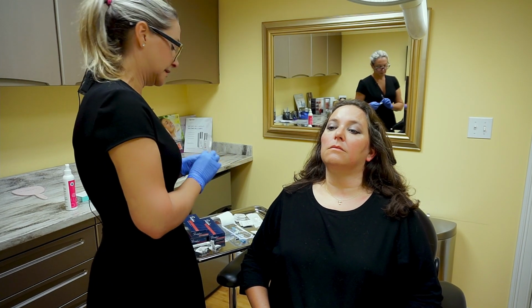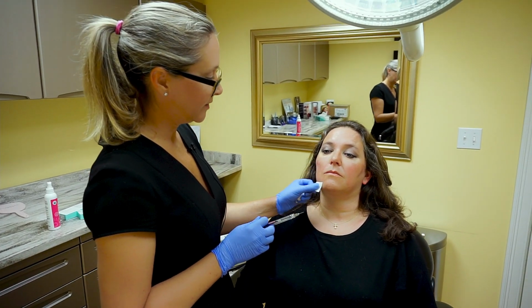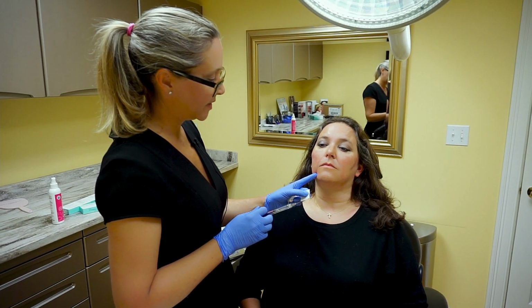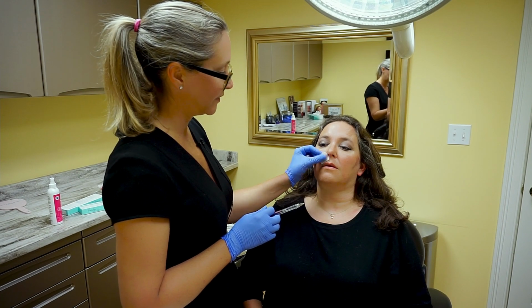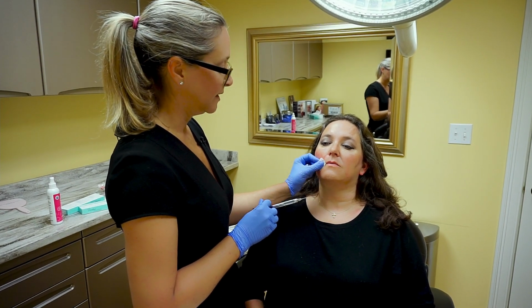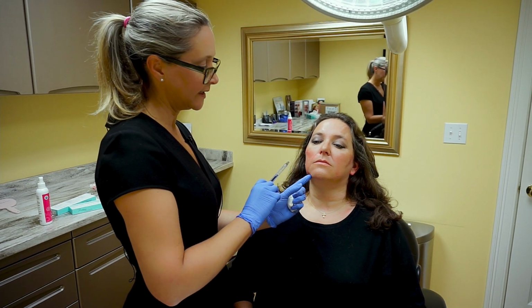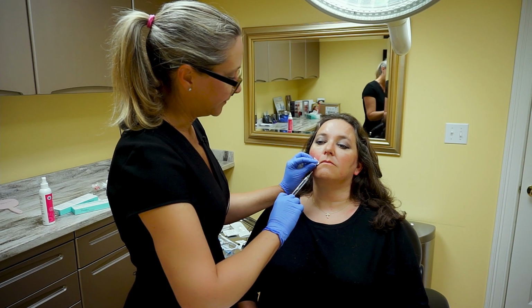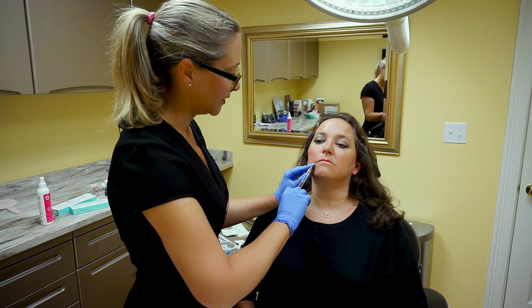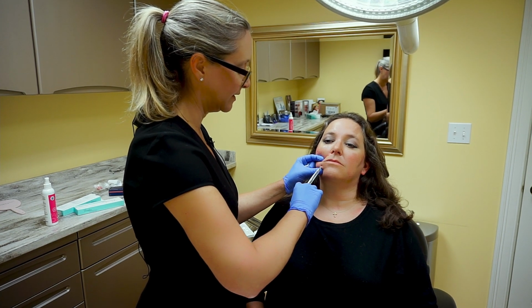That looks nice. I'm going to inject a little bit around the, this is what becomes a marionette line. Jody doesn't have bad creases or marionette lines, but she's a little bit of an indentation. Some people it indents all the way down there and you get that puppet looking line. Jody doesn't have that, but she has just a little indent there.